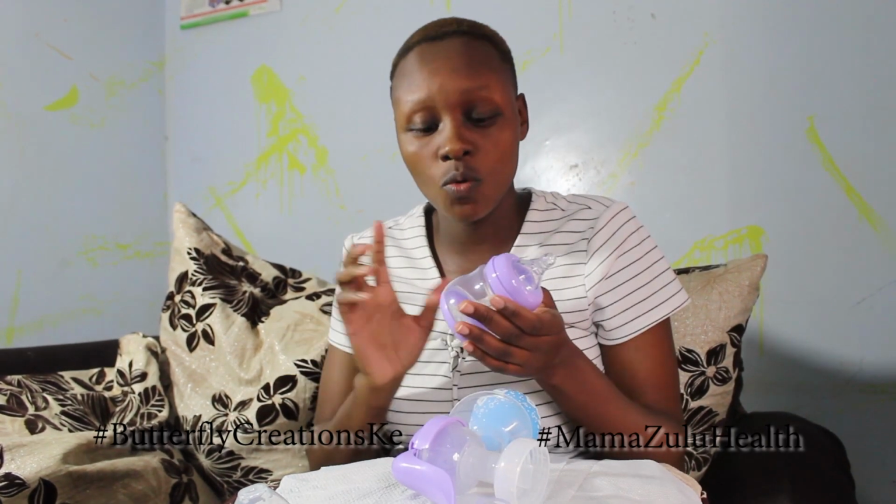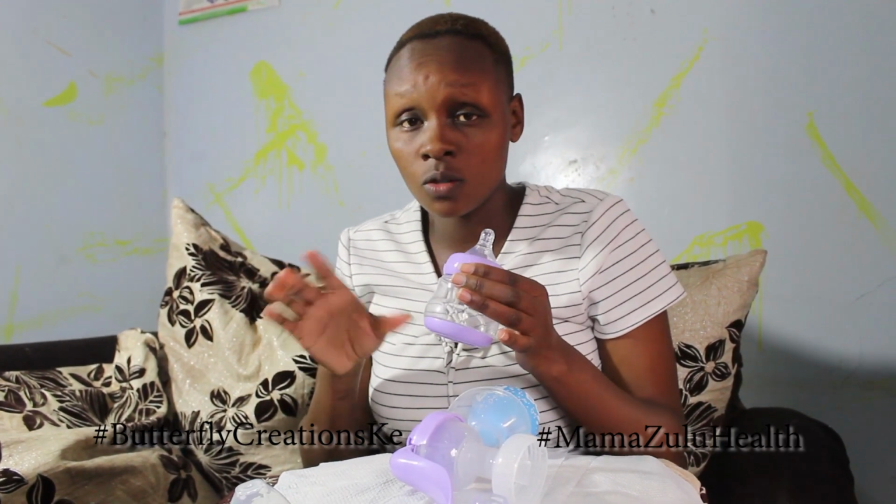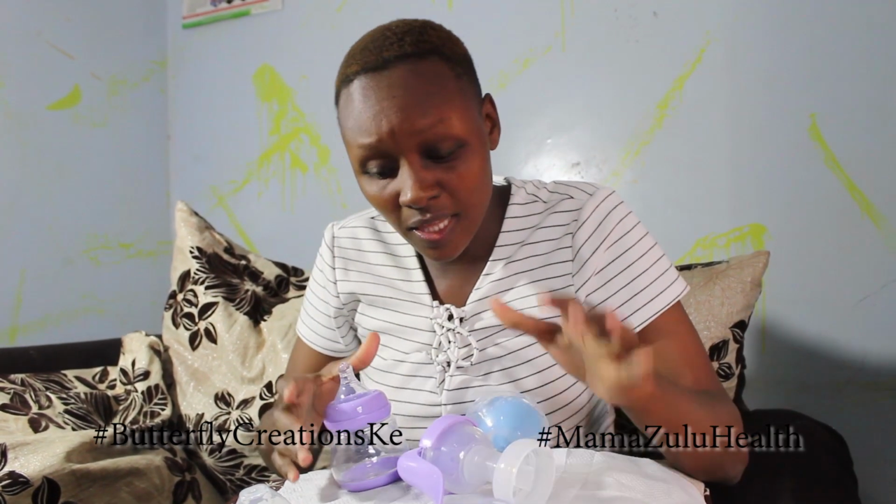But it's not advisable to store in this, because the next time you want to pump, where are you going to put the milk? It will be very cumbersome, and you don't want to keep transferring, because hygiene issues again apply. So you don't want to do all those things. Make sure you have enough feeding bottles to transfer all your milk. And then once you're done, clean everything thoroughly, and then you can assemble this.